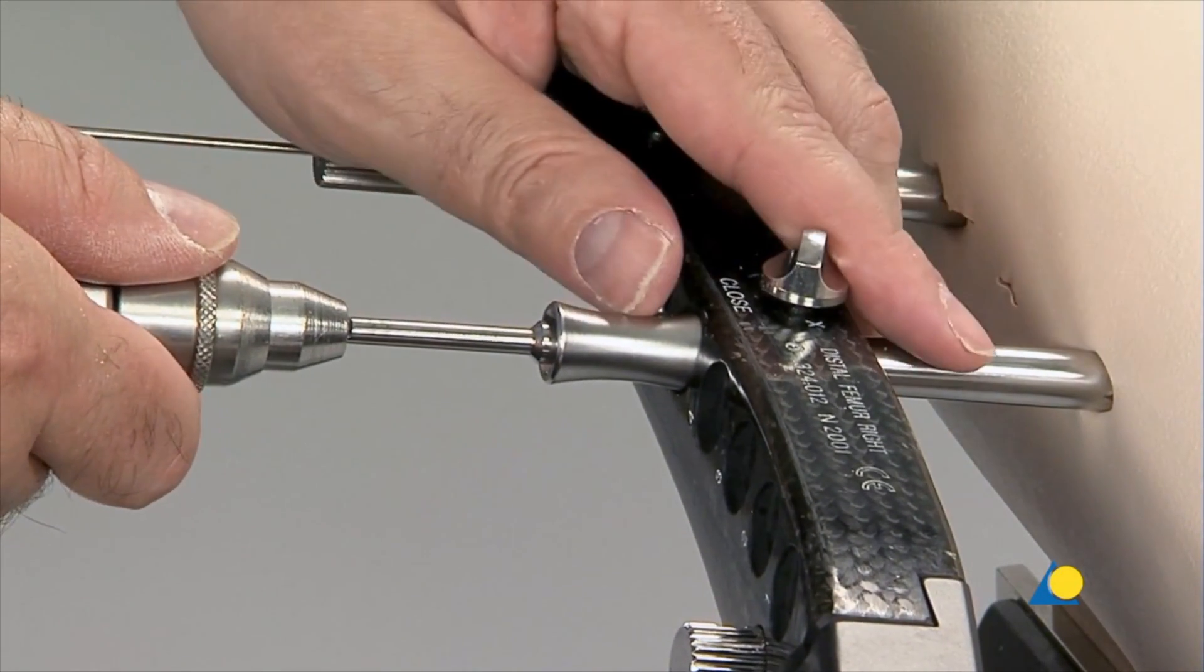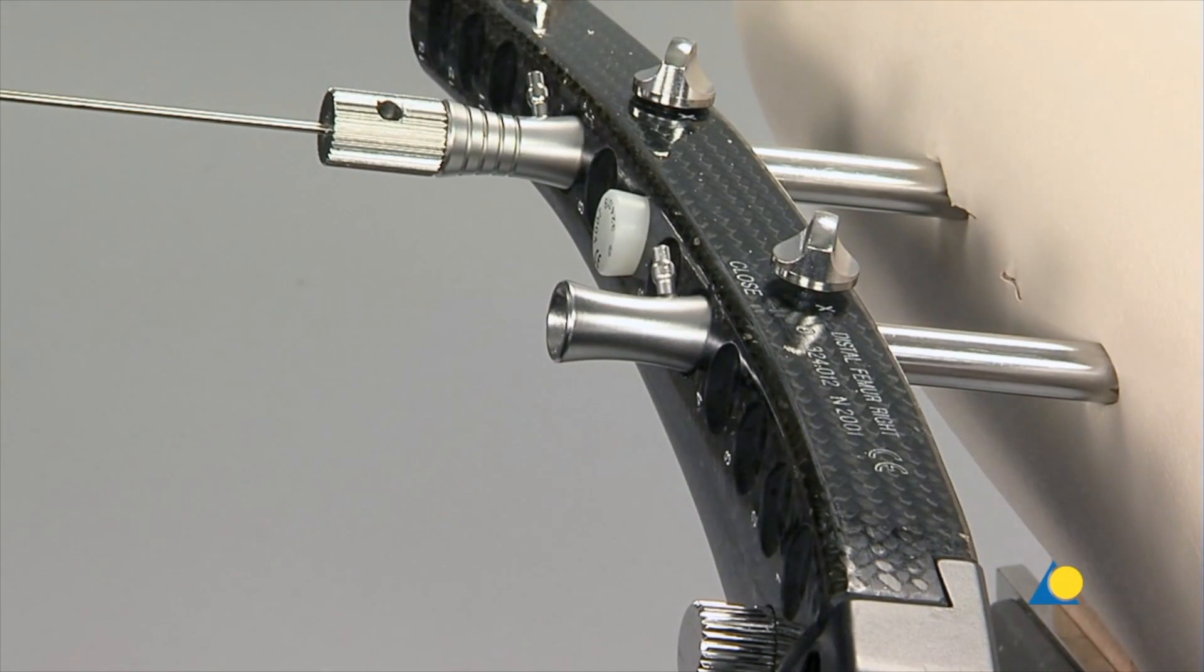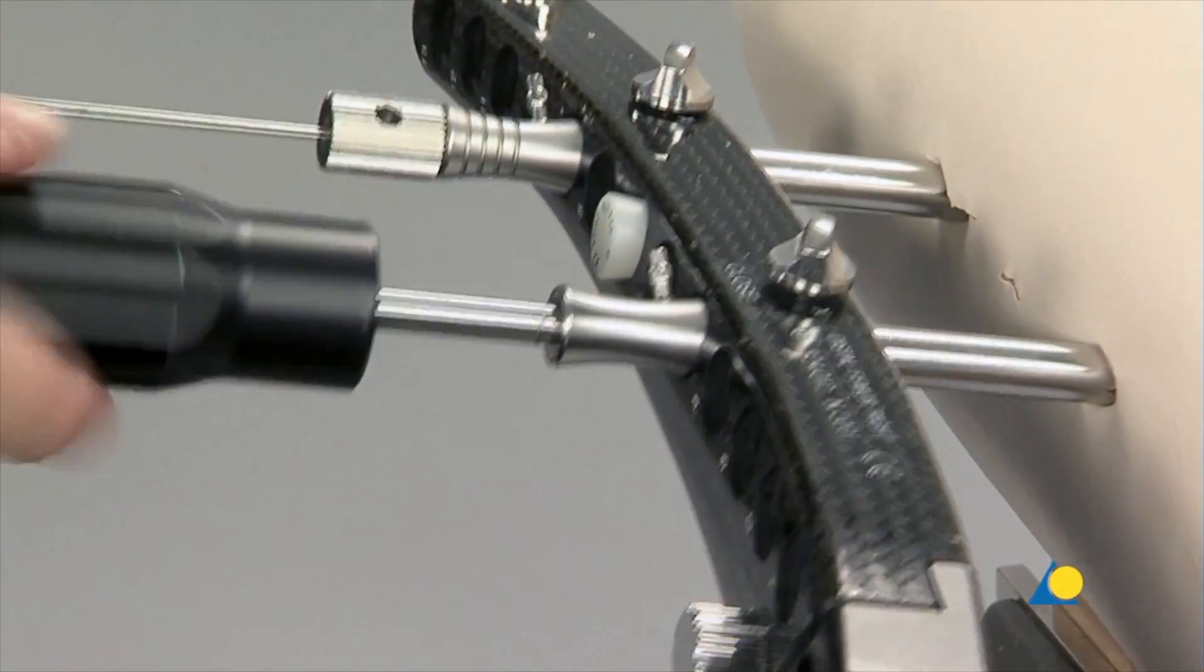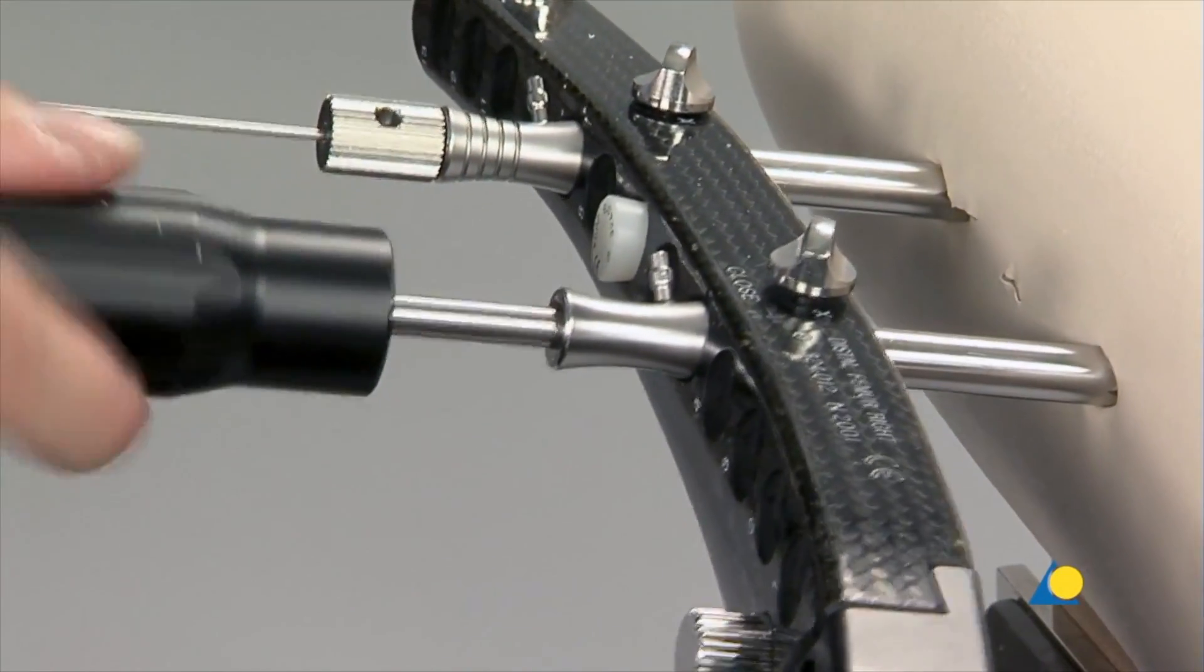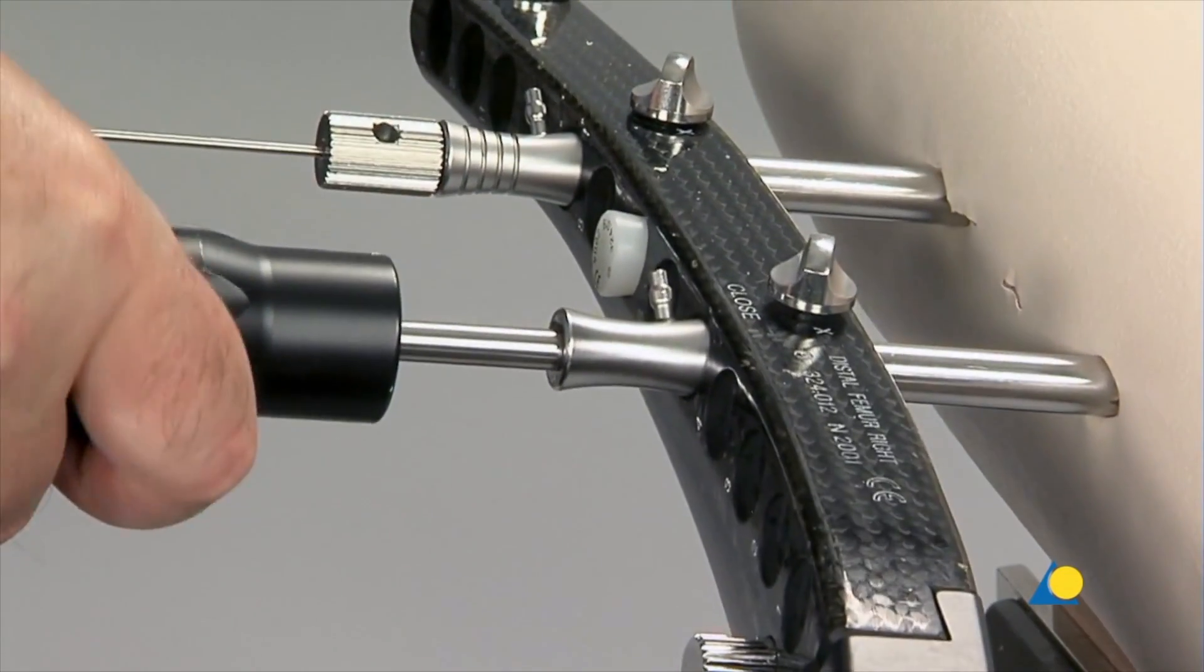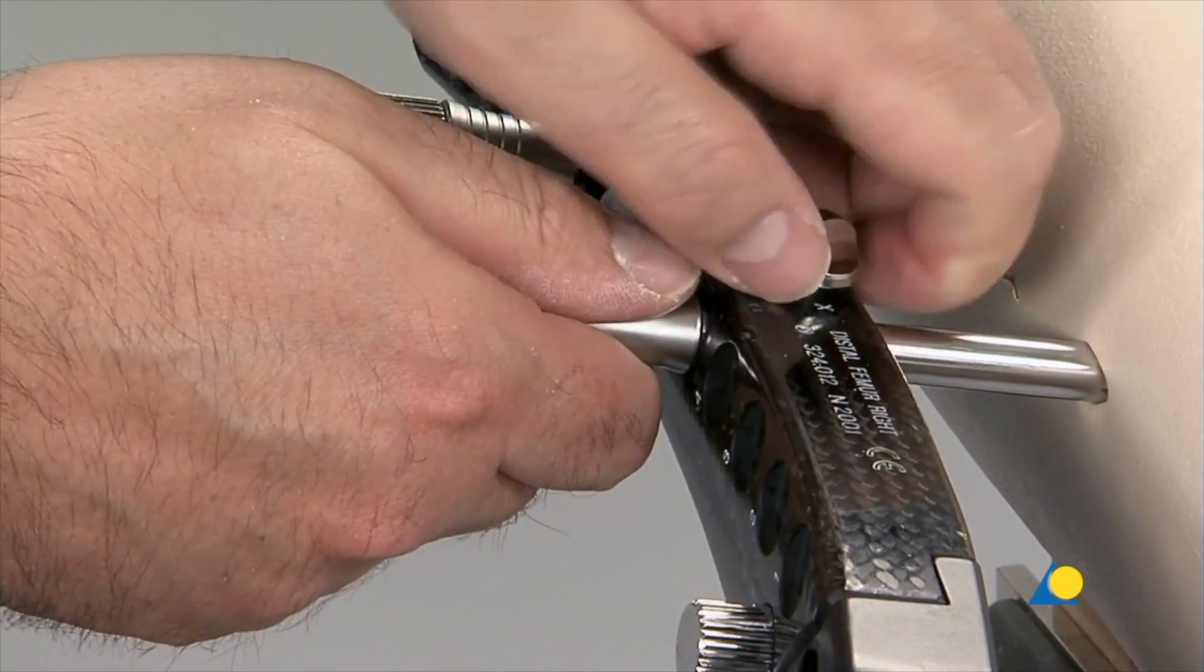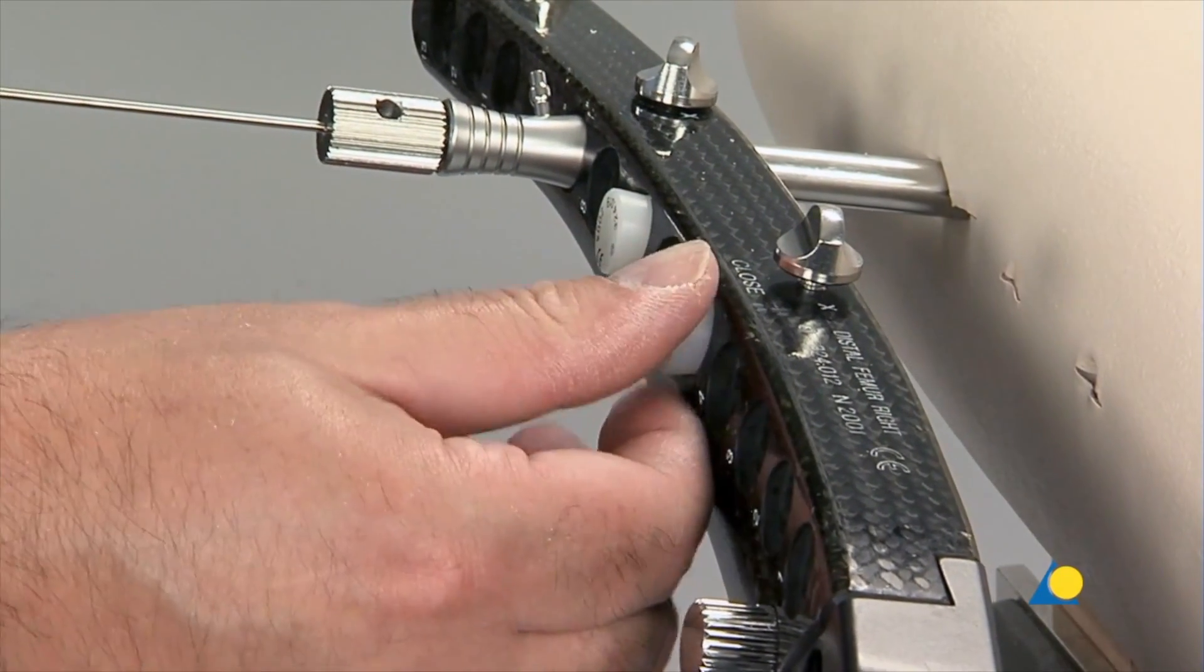The LCP plate holes in the shaft also allow insertion of cortex screws. However, as the aiming arm only permits the insertion of locking screws, the aiming arm must be removed, and the cortex screw inserted in the usual manner. Two bicortical and one monocortical screw will be placed in the femoral shaft. In osteoporotic bone, more screws can be used. However, the fracture must be bridged, so at least two plate holes must be left free.